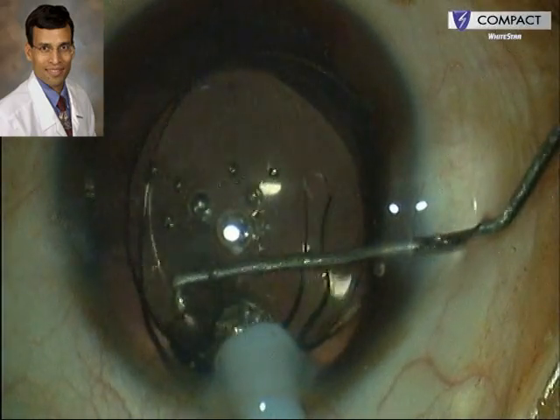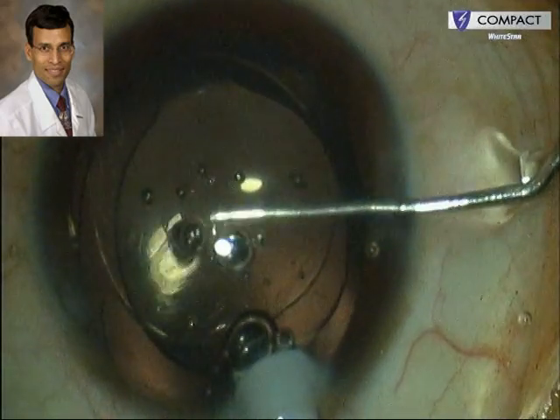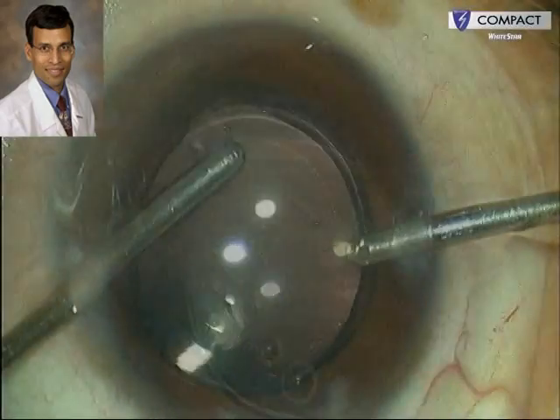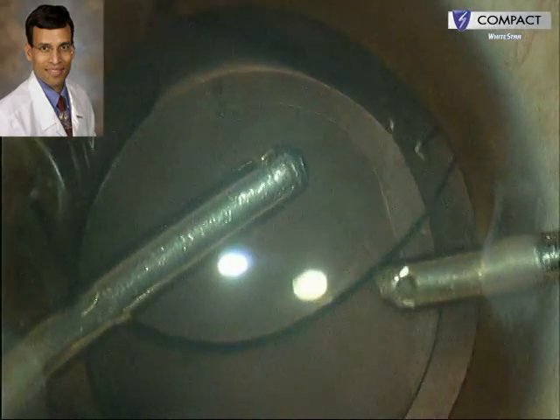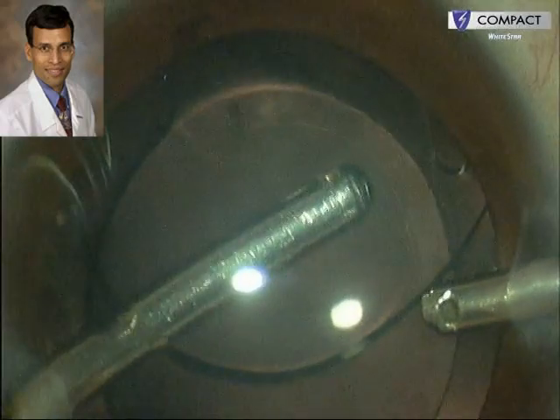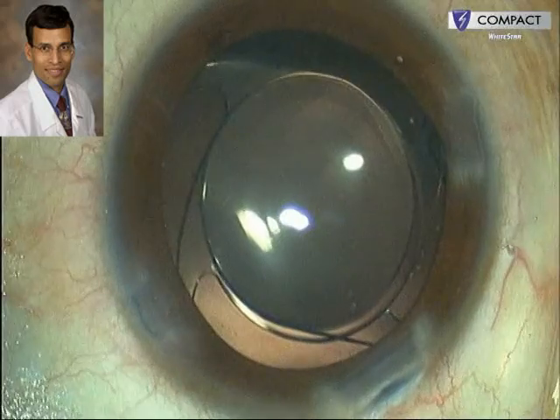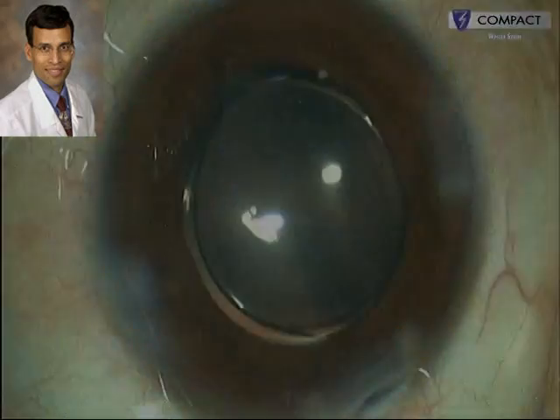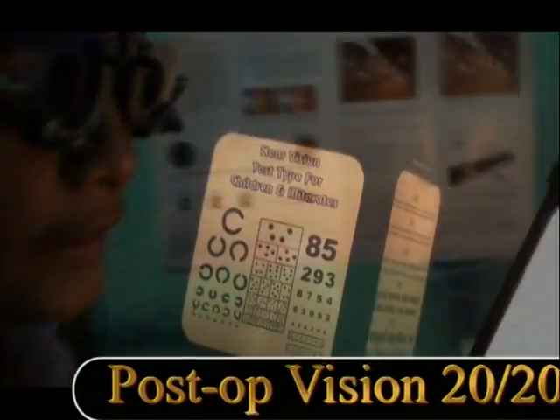The alignment of the secondary piggyback IOL haptics can either be along the same direction as the previous IOL or aligned 90 degrees opposite to the previous IOL. In case of a toric IOL previously in the capsular bag, we must take care during implantation of the secondary piggyback IOL not to disturb the positioning of the toric IOL. The viscoelastic is then removed from between the IOLs. This combination of placing one IOL within the bag and another in the ciliary sulcus, using one hydrophobic acrylic and one hydrophilic acrylic IOL, minimizes the chances of developing interlenticular opacification or the red rock syndrome.